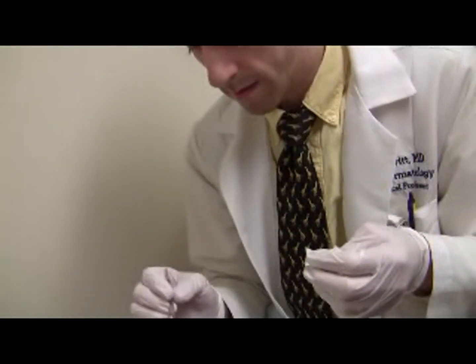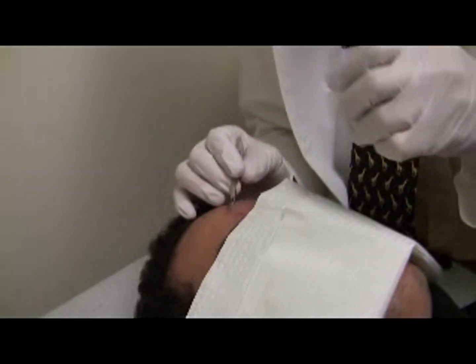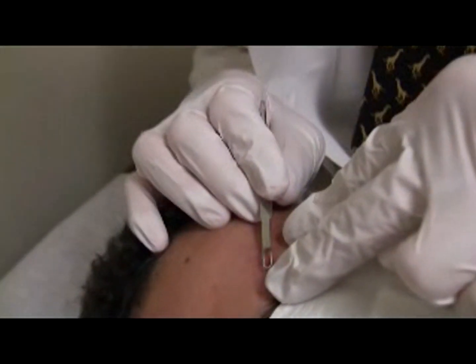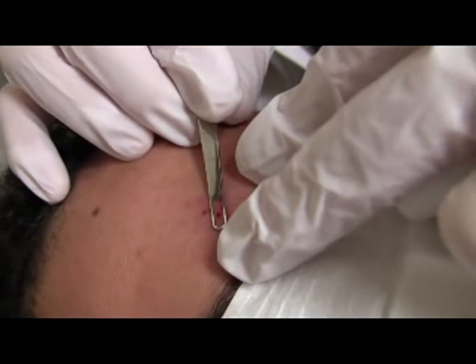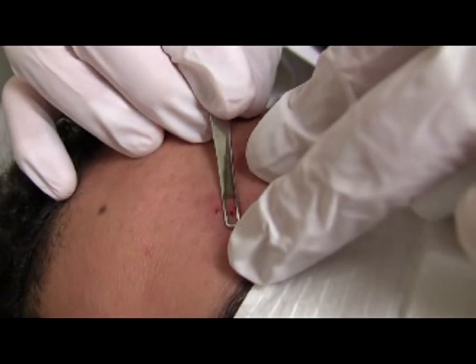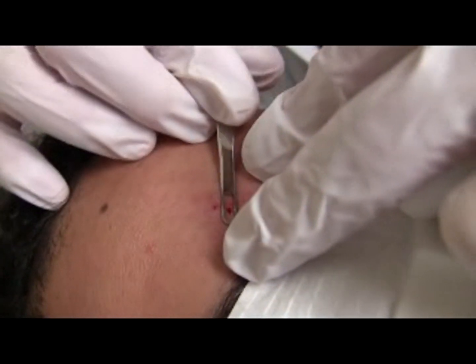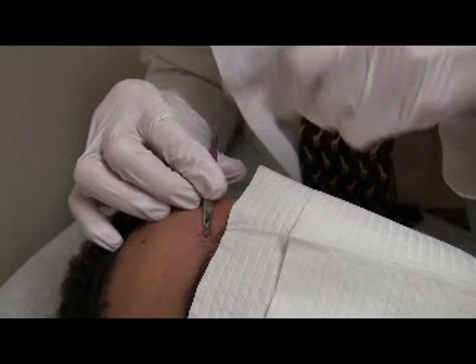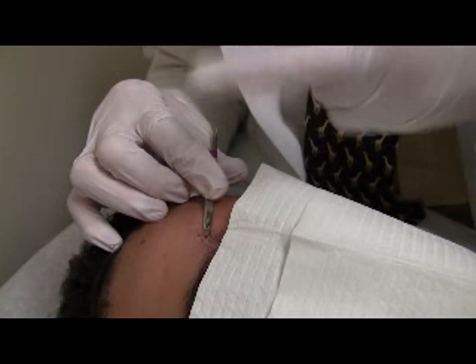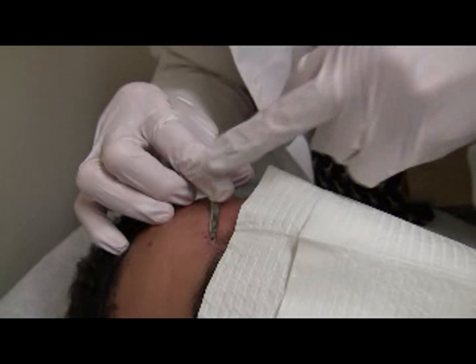The takeaway point is: once you are finished with the 11 blade, put it down and pick up the comedone extractor or gauze. Put the loop of the comedone extractor over the lesion — be sure the lesion is at the center of the oval loop, not at the loop's distal edge. Apply downward pressure. You'll notice my thumb is on the bottom and the index finger is on the top, like a lever with the fulcrum at my thumb.